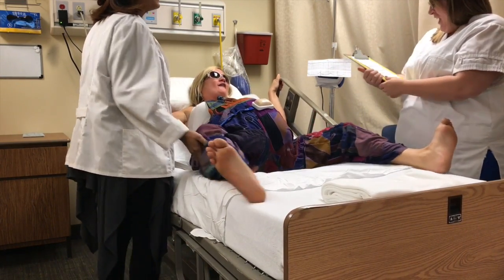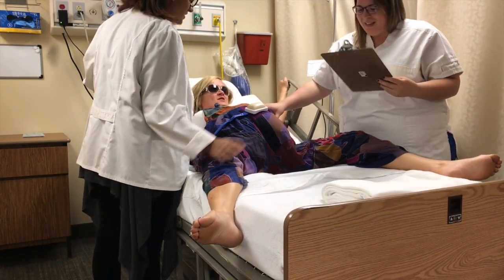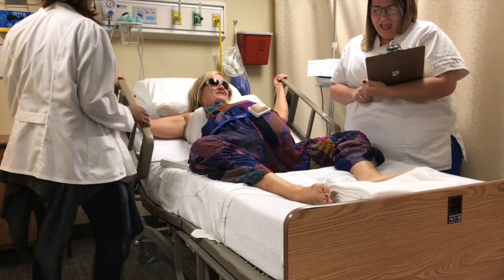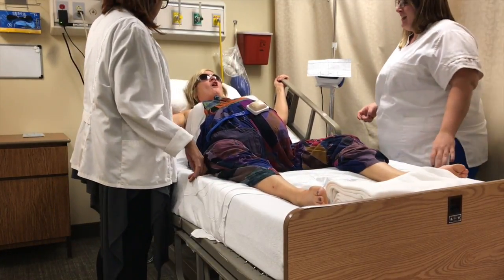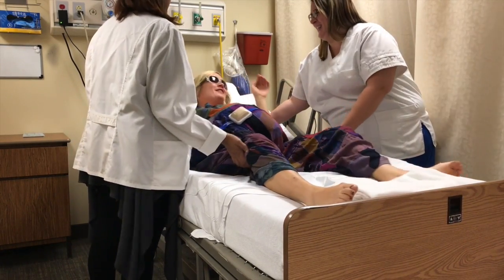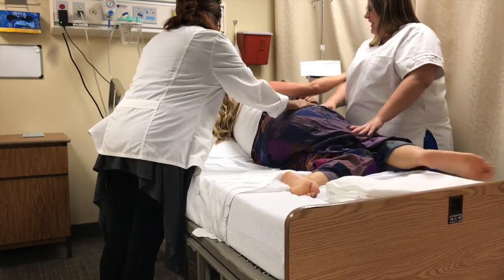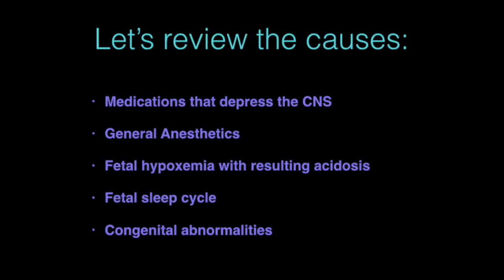So Nurse Carrie, what can we do to help her? We're gonna stimulate the baby's scalp. We're gonna connect the scalp electrode. What? And we're gonna position the client in a left lateral position. All right, we're gonna move you to your left side. All right? Okay. That's left. Your other left. Oh, this will help you with your pain. How's that? Yes!